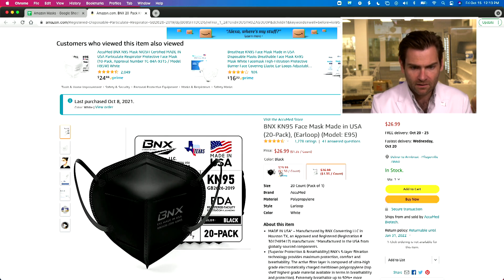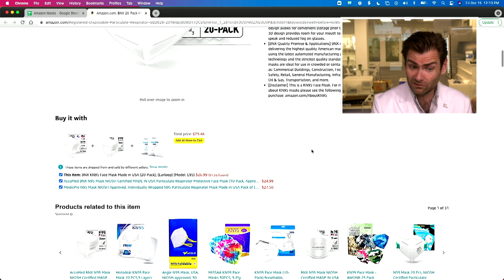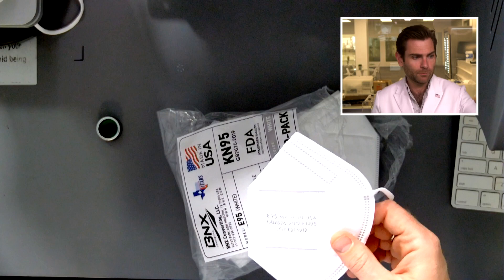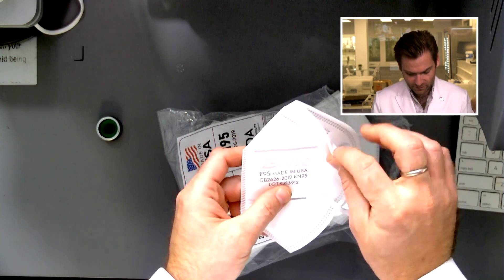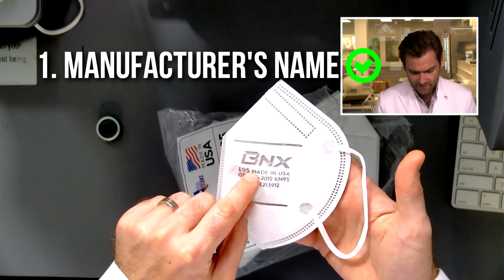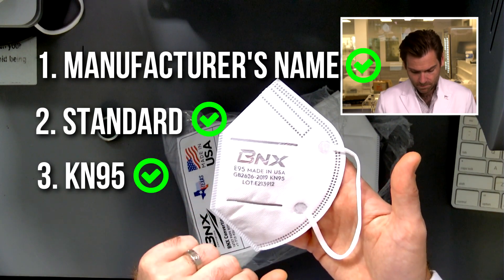You can get it in black or white, and it's manufactured in the USA by BNX Converting. It looks like a quality mask. So, why is it a KN95? You need three things: the manufacturer name — BNX, emblazoned on the top — the standard GB2626-2019, and the KN95 designation.